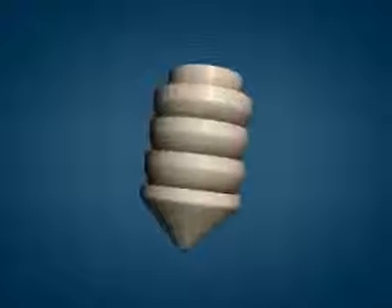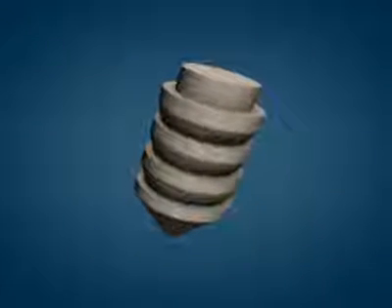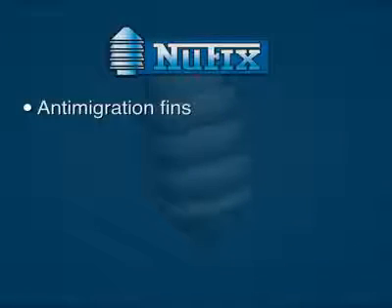NuFix provides a posterior spinal solution through facet fixation by stabilizing the spine and reducing pain. Anti-migration fins are unique to NuFix, providing resistance to graft migration.